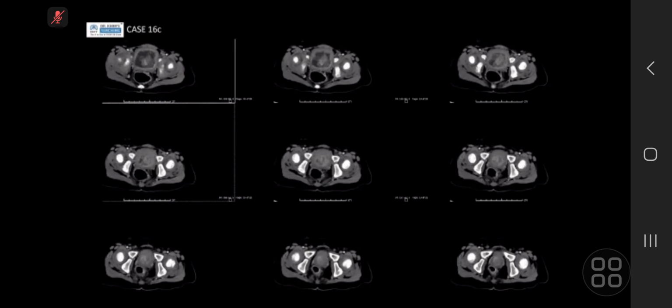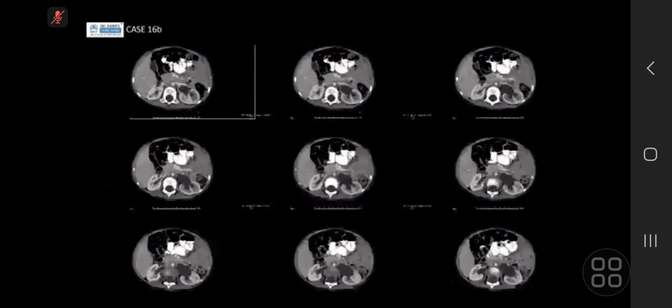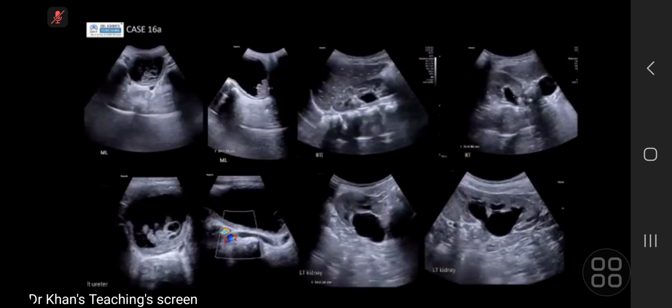1 year. So for my differential diagnosis, have they done any color Doppler over the bladder? Can I go to the ultrasound? Yeah. So I think I did an ultrasound. There's just minimal vascularity, but there is internal vascularity.